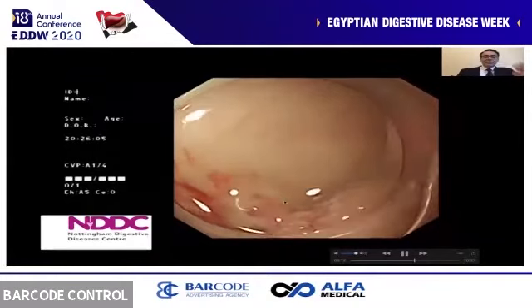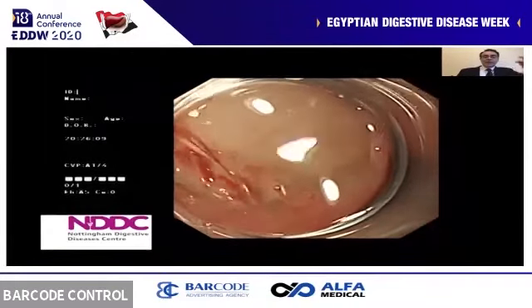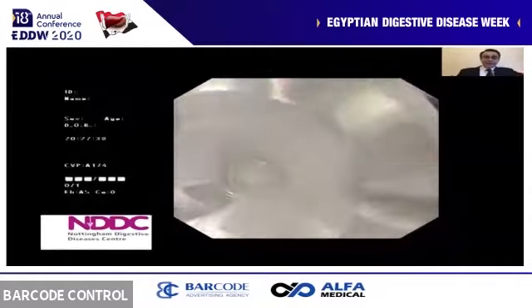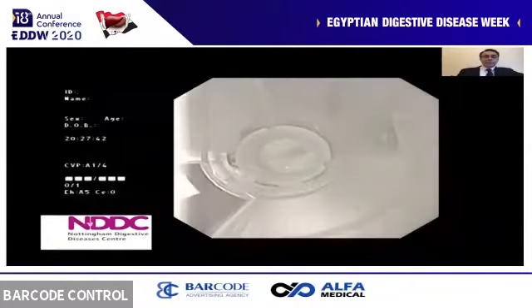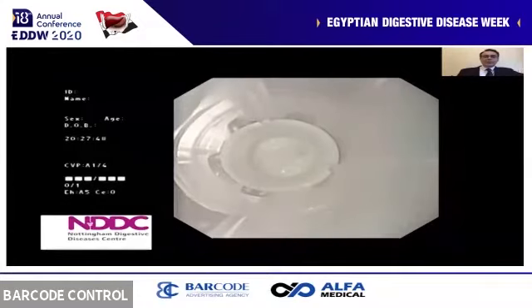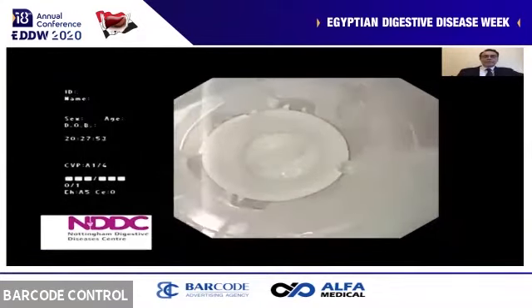This patient, on hemodialysis and with a lung cancer, had endoscopic treatment for an acute bleed, had a cardiac arrest, had embolization, and still rebled. And the surgeons were taking him to theater for surgery, but they asked us to have a look and see if we could apply some sort of definitive treatment. So my first option, of course, was an over-the-scope clip.